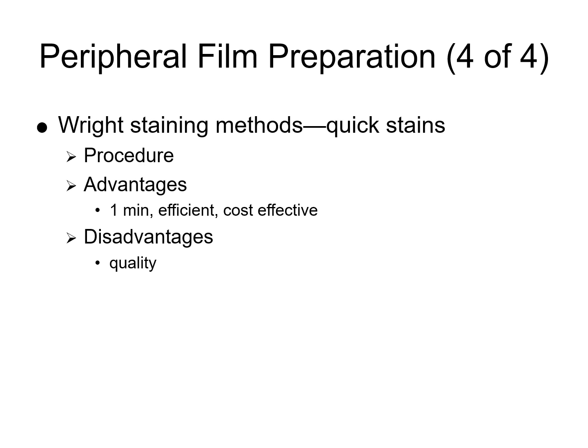But of course, there are some disadvantages, quality being one of them. Quick stains often provide less detailed cellular morphology and may compromise staining quality compared to standard Wright Giemsa stains. It may result in less optimal differentiation of cell components, which could potentially affect diagnostic accuracy.